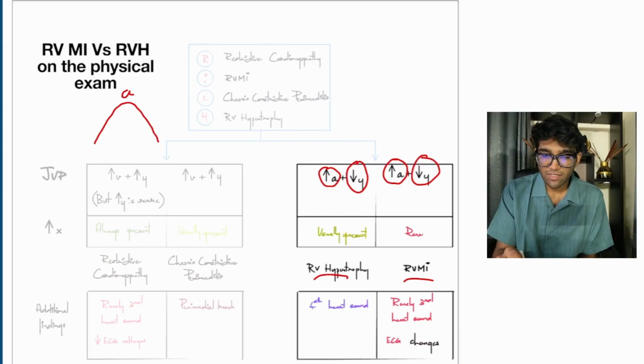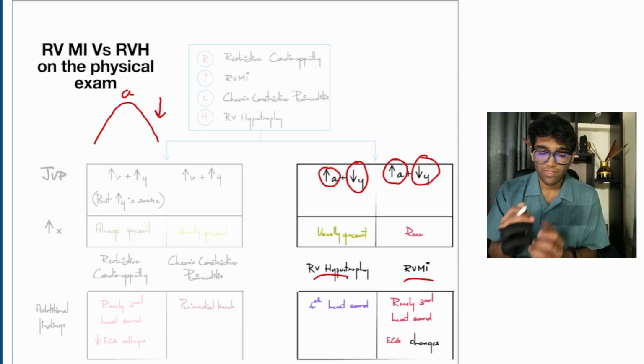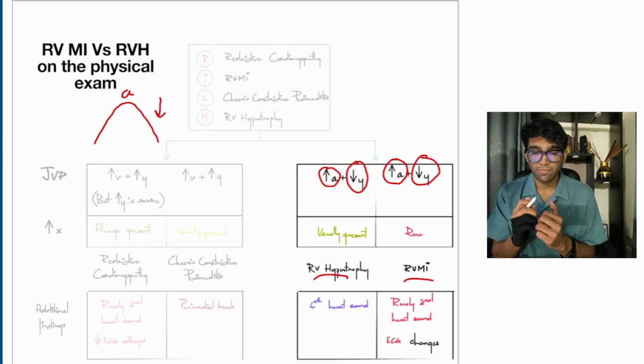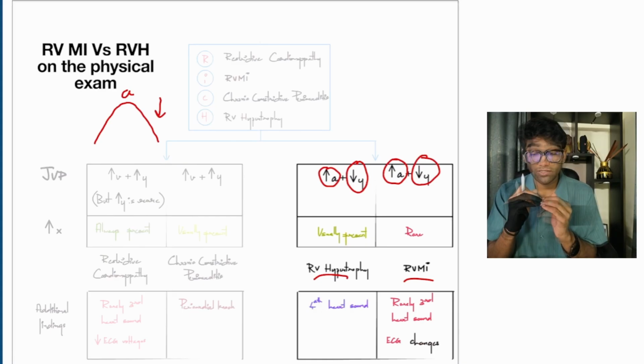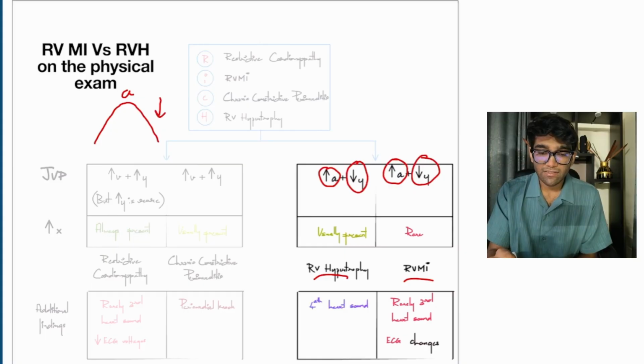As the atria start to relax, there is a decrease in pressure within the atria. After that, the ventricles start to contract. Initially, during isovolumetric contraction, the pressure within the ventricle increases, but the volume doesn't decrease. As the volume does not decrease, the tricuspid valve leaflets protrude into the right atrium, decreasing the atrial volume and slightly increasing the pressure. This is what we call the C wave.